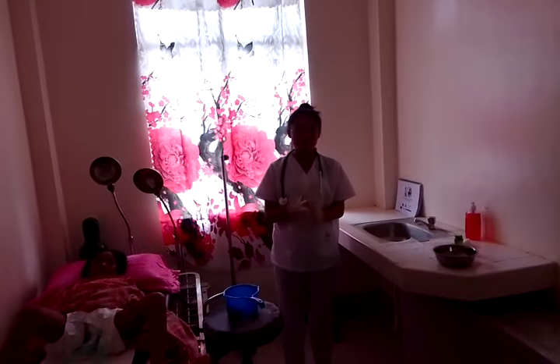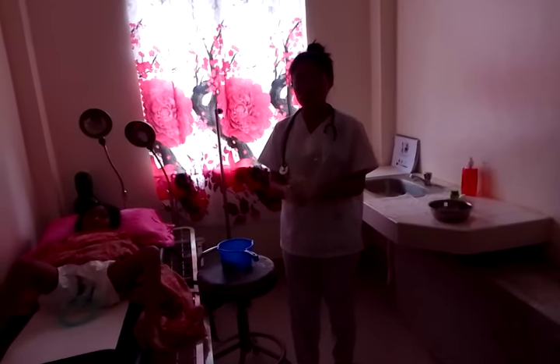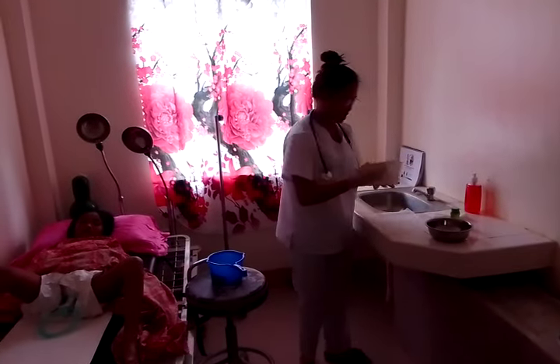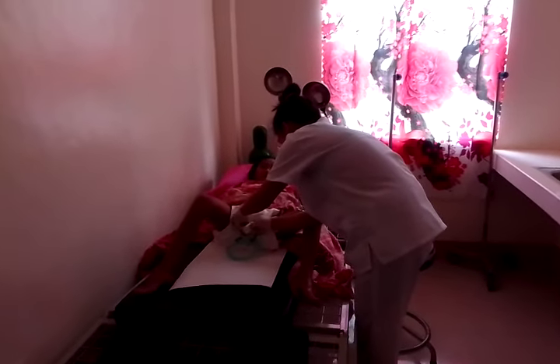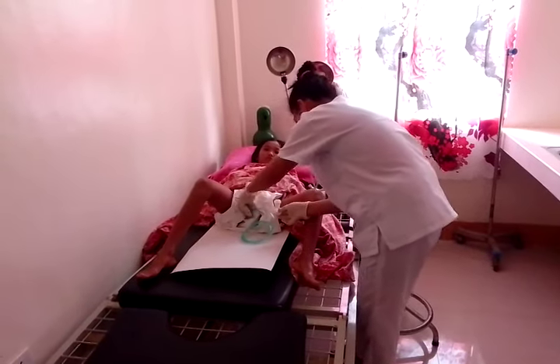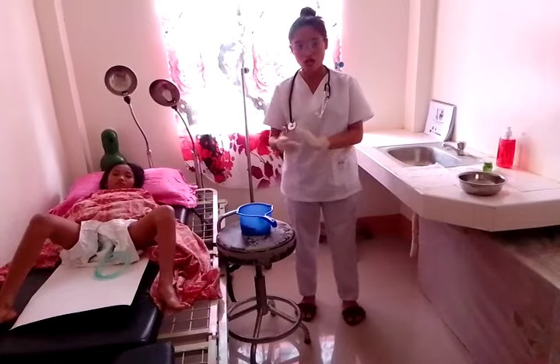While holding the catheter at the meatus without tugging, dry at least four inches of the catheter, moving away from the meatus using a dry towel or washcloth. Since the catheter area is wet, we need to dry it. Get another clean washcloth to dry the catheter, making sure to hold the catheter while drying. Place the used washcloth directly into the waste receptacle.